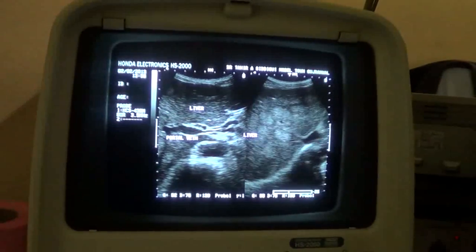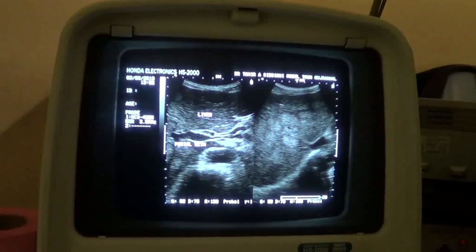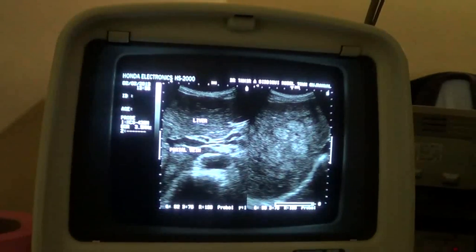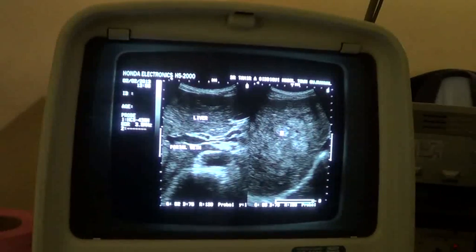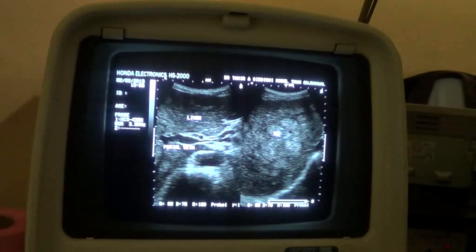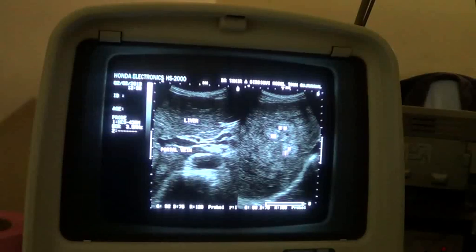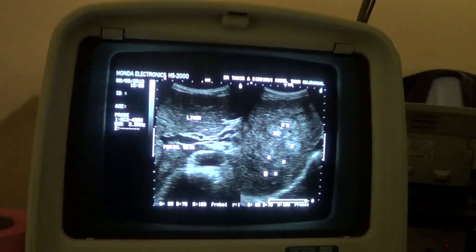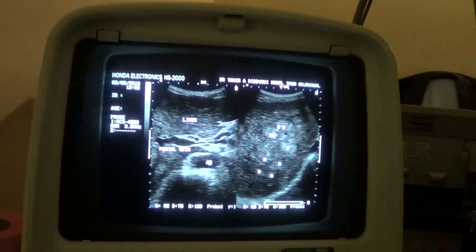You don't see any other finding, except these globular echogenic areas that are all consistent with the metastatic lesions of variable sizes. The M denotes focal lesion, and they are seen in all segments. This is the aorta.